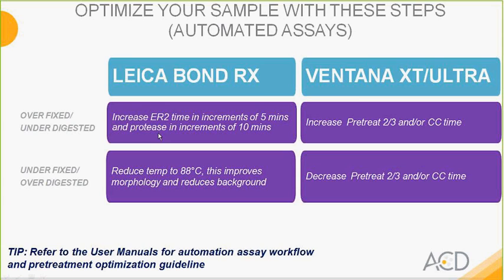To optimize your automated assays, here are recommendations for Leica BOND RX. For overfixed samples, you should increase ER2 time in increments of 5 minutes and protease time in increments of 10 minutes. For VENTANA, increase pretreatment 2 and 3 and/or cell conditioning time.